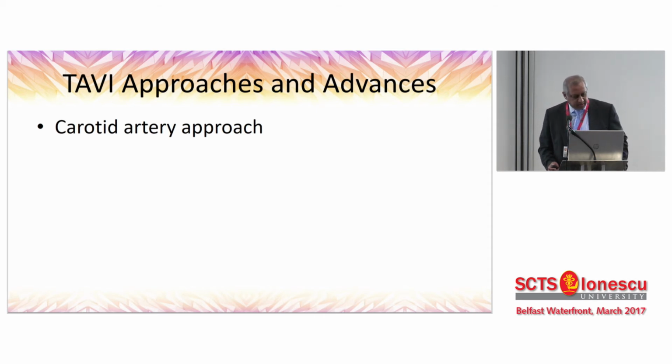Some previous teams have used a carotid artery approach. I'm not too sure how much it will remain popular, and I think it died a bit of a quiet, painful death. And it's not used very much anymore.